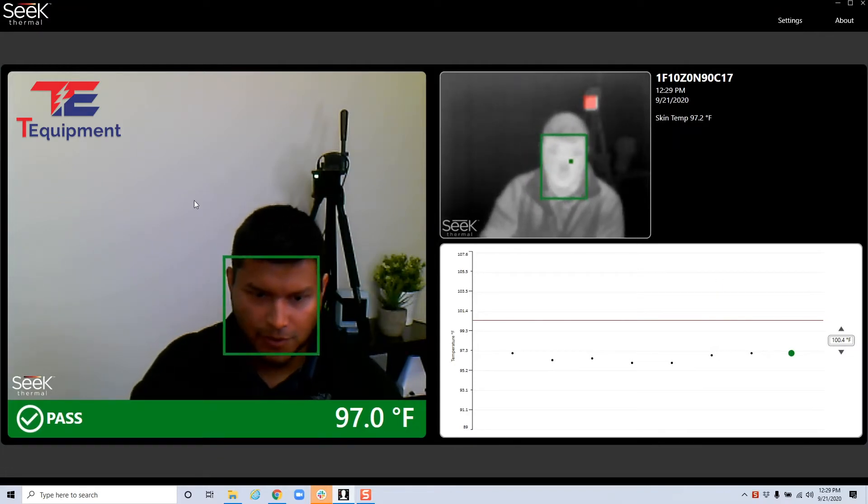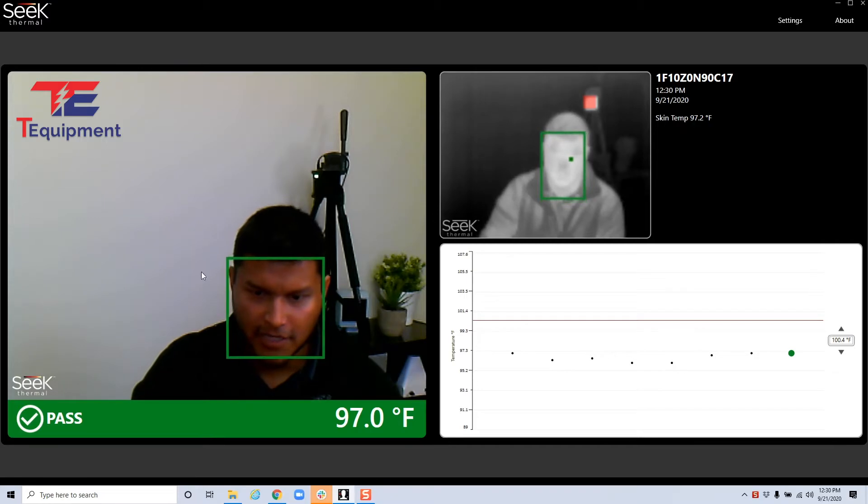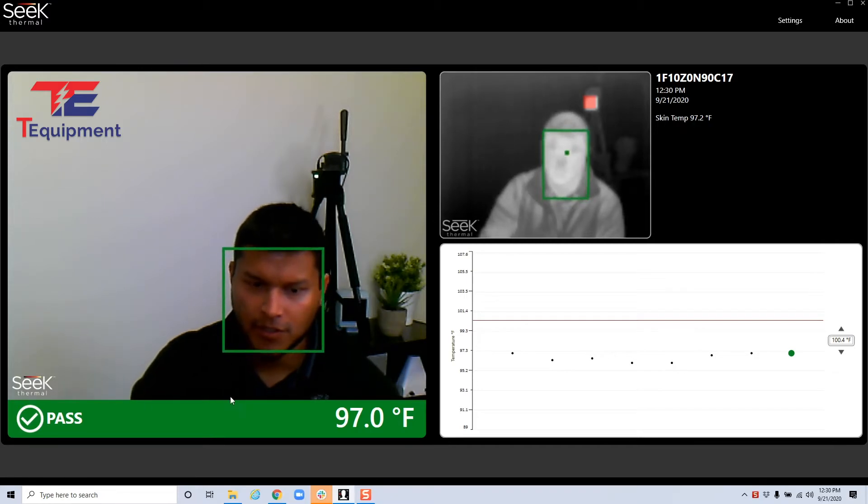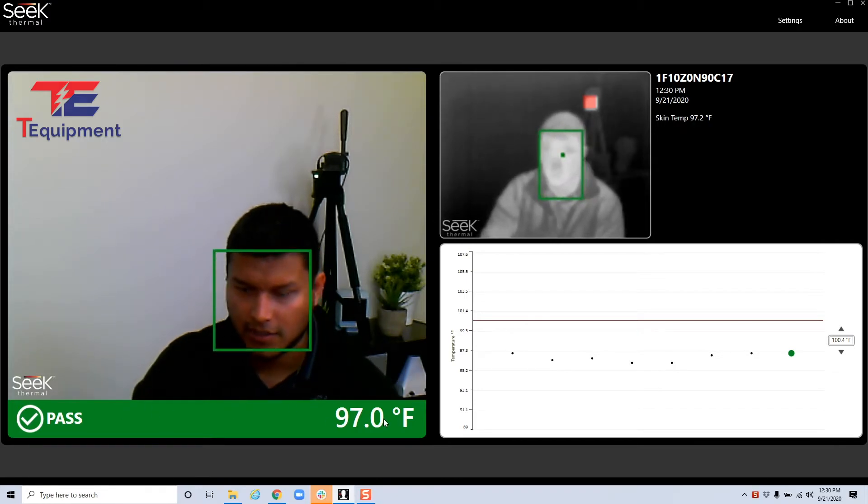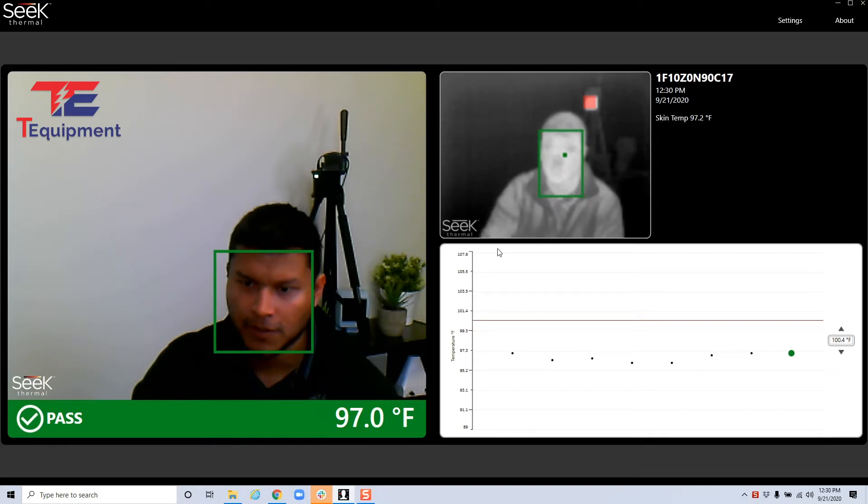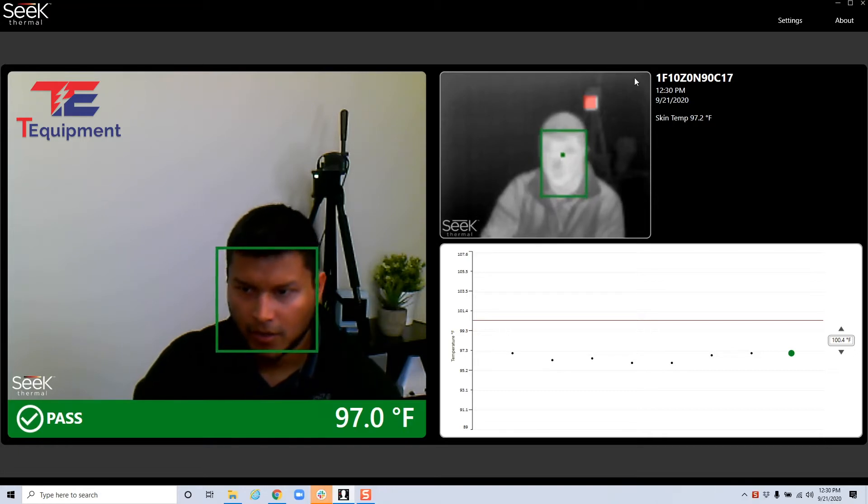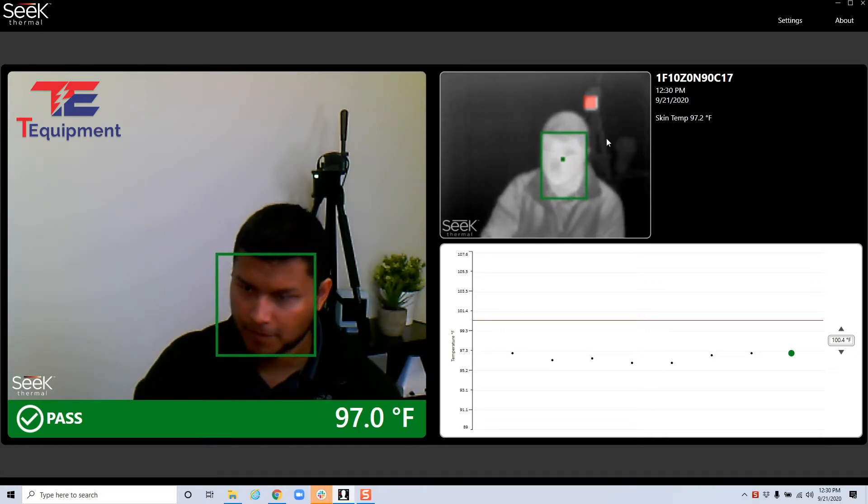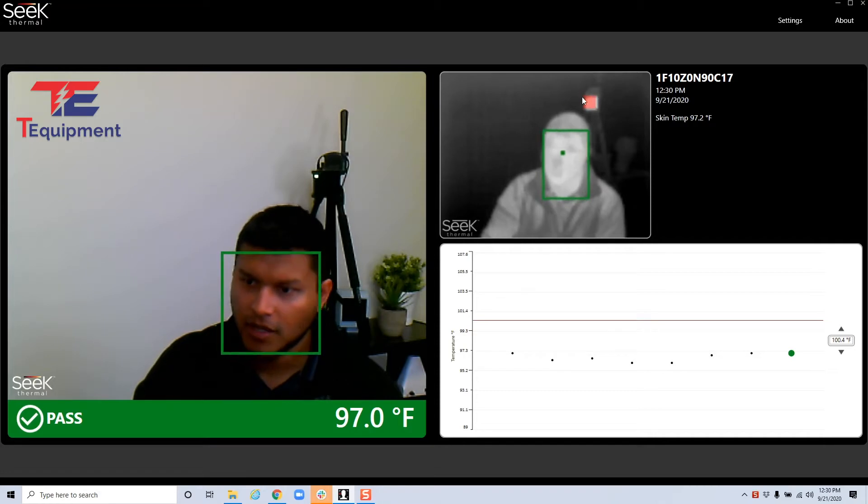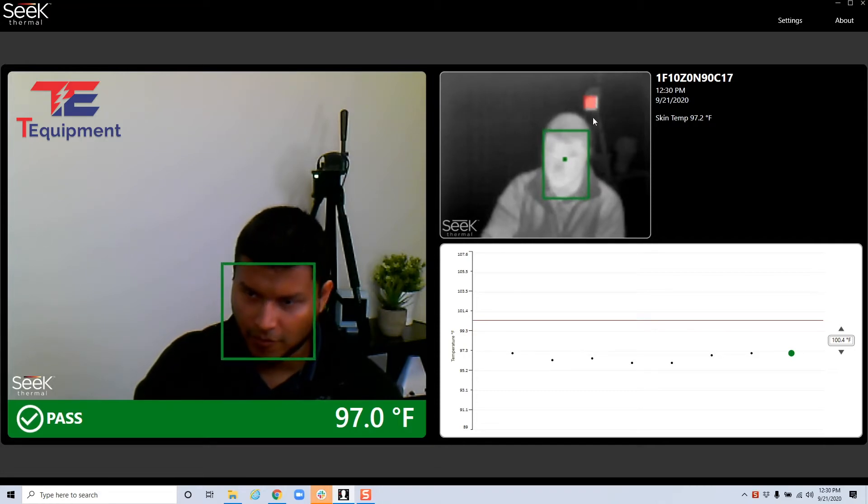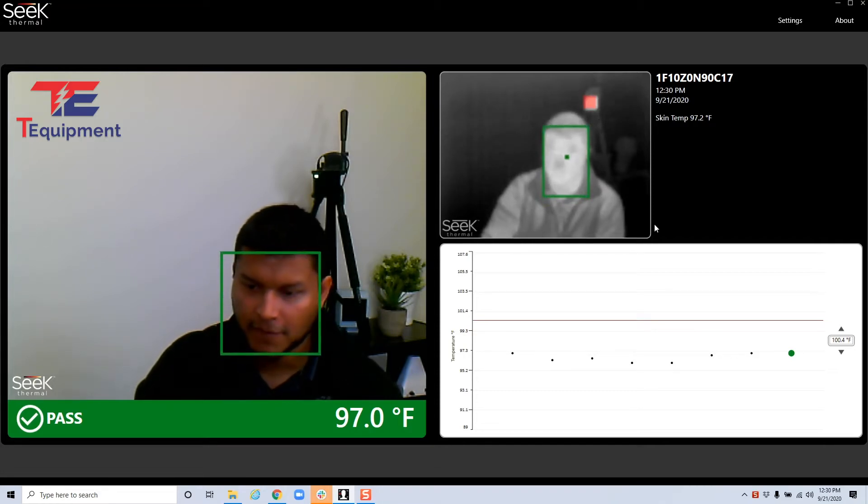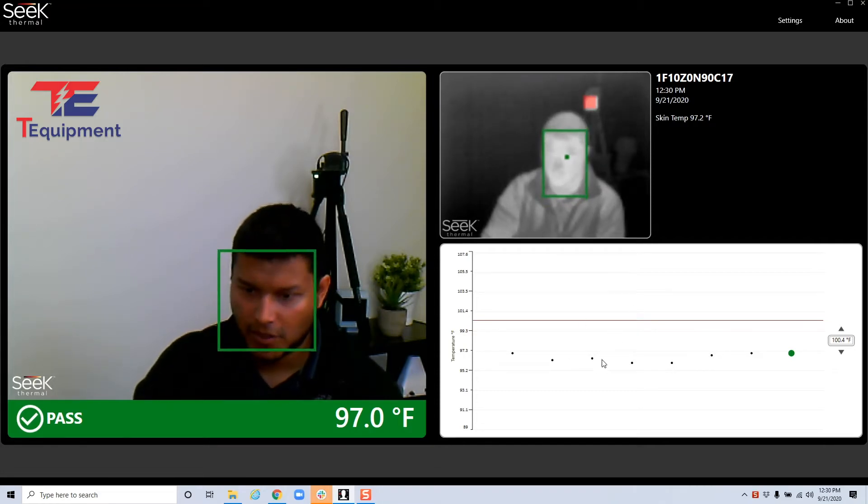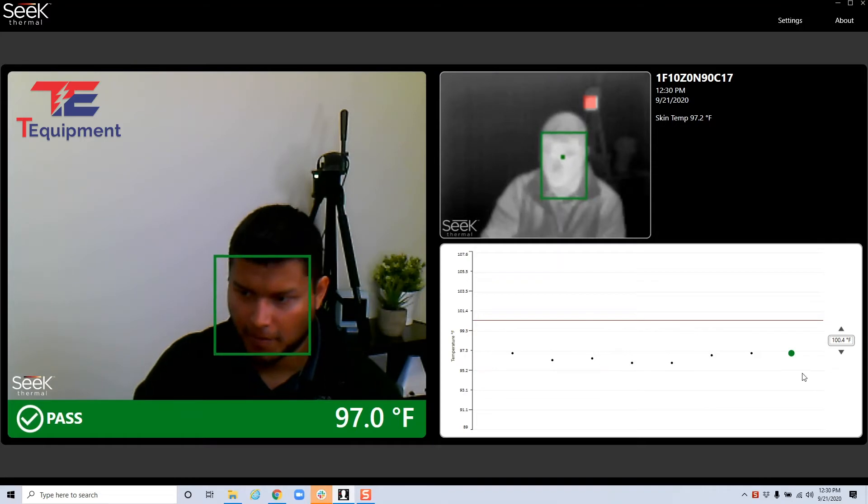You'll notice there's some familiar settings on the left side of your visible image with your pass and a temperature measurement. On the right side you have your thermal view here with the black body calibrator, the red box there, as well as the graph over the past couple of readings.